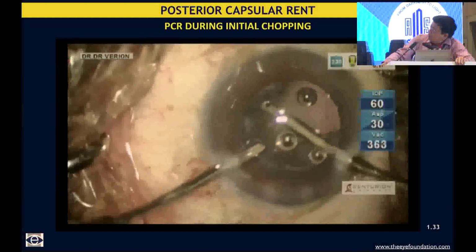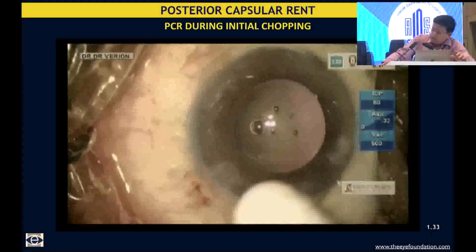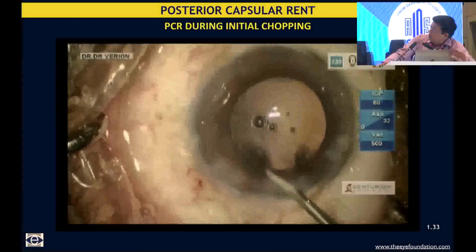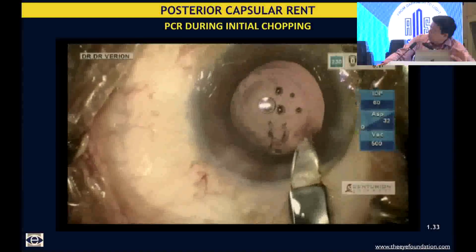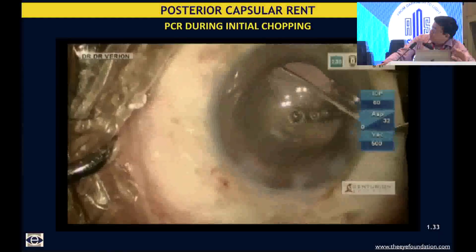Instead of allowing this to persist in the patient's eye for weeks together, nowadays sutureless vitrectomy is possible, and this needs to be attended to right there and then. There's not a single case of dropped nucleus I'm going to show, because I believe that all the audience here are anterior segment surgeons, and once the nucleus slips inside, it's beyond the scope of control, and they need to call in a vitreoretinal colleague to go ahead and handle it.